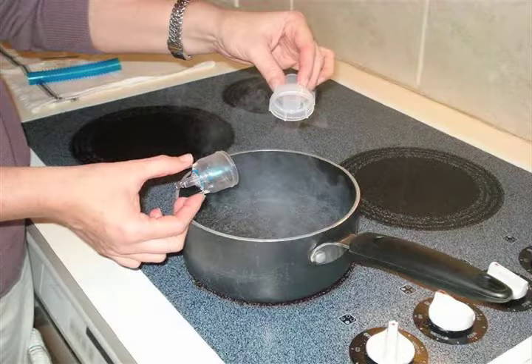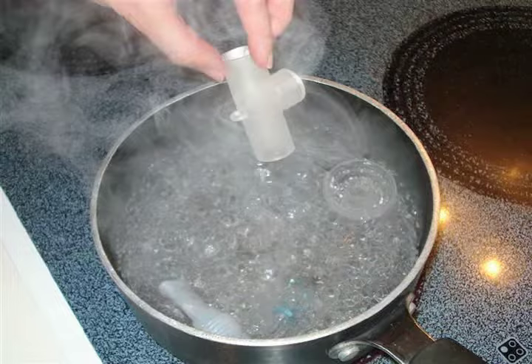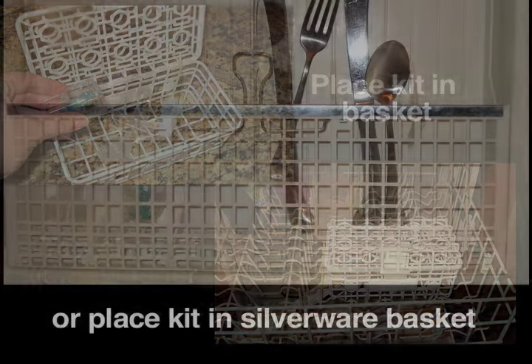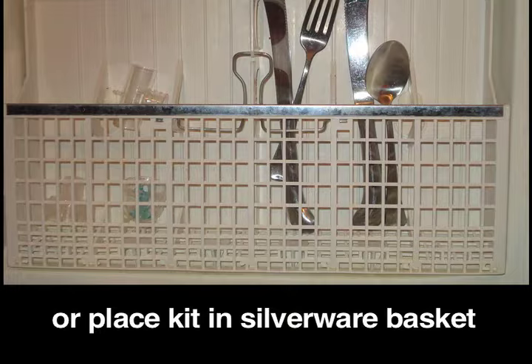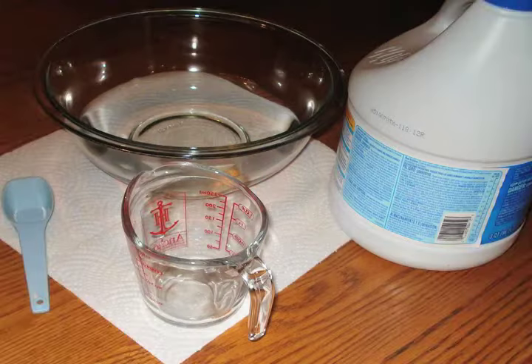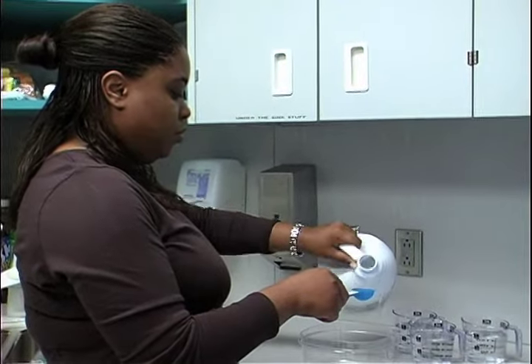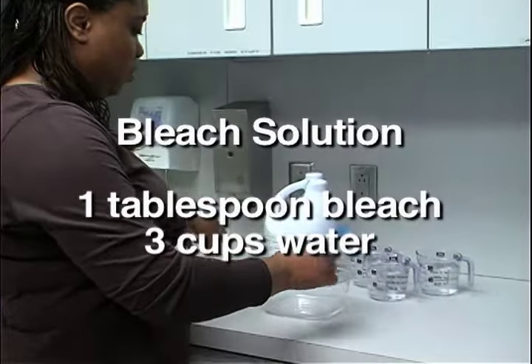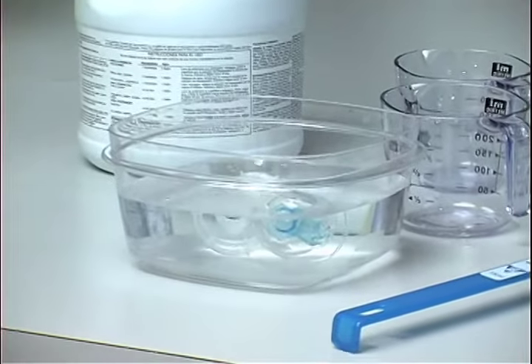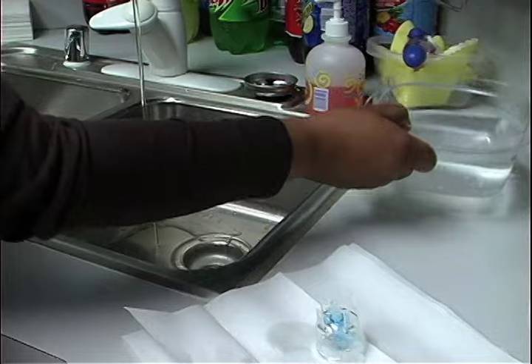Once a week, the nebulizer kit should be sanitized. You can do this by either boiling the parts in water for 5 minutes or putting them through a cycle in your dishwasher. An alternative to these methods is soaking them in freshly made bleach solution. The bleach solution is made from 1 tablespoon of bleach added to 3 cups of water. Soak the parts for 3 minutes, then rinse with clear water. Place the nebulizer parts on a paper towel to air dry and discard the bleach solution.